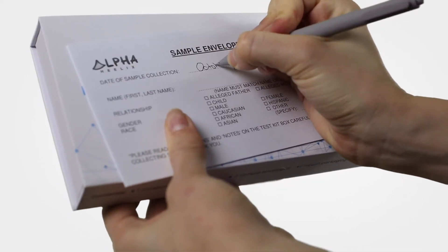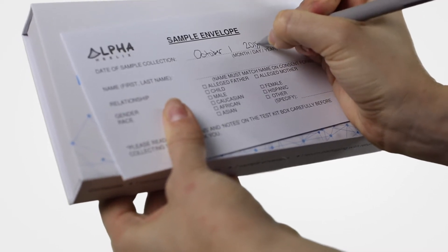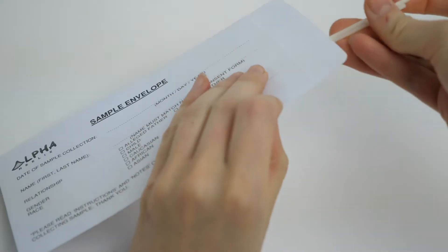Once you have done that, remove and dispose of the plastic packaging of swabs, and run two swabs for each individual being tested, one at a time on the inside of both cheeks, for at least 20 seconds to get a good DNA sample. It's best to do this in the morning. After you have the sample, place both swabs in the sample envelope and seal the package.